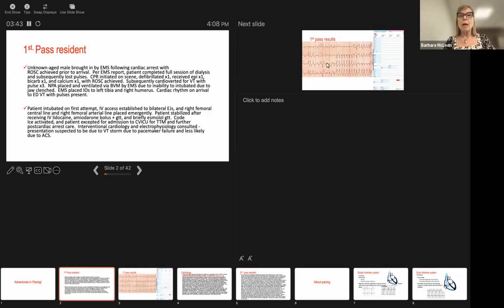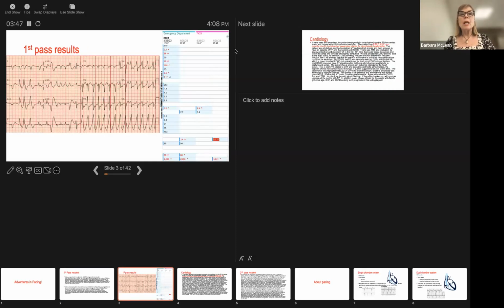So I want to take a look at our patient's first EKG, and I want to also take a look at the patient's evaluation lab. So on first pass, what we're seeing here is a patient who has an irregular rhythm. Now, remember, whenever you have an irregular rhythm, the expectation is that that is not VT. Also, when you take a look at this, what you have is what we call negative concordance. Now, VT typically means that the direction of your primary R or your QRS is always pointing in the same direction, and you can see, indeed, that is not true here, okay? This actually looks like a pacemaker malfire, or possibly AFib.